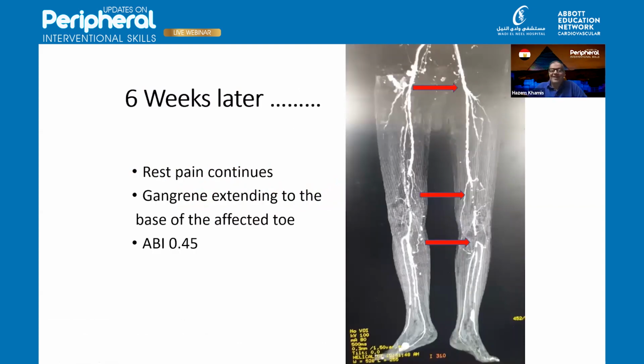Sharif, before this CT angio, Alberto, would you try again with a high pressure balloon, long balloon inflation, and then decide whether to leave the entry point or stent this entry from the start? I tell you, my position today is that we have really to look at the inflow status in a patient with a true critical limb ischemia, because we have seen that the distality in the toe is not absolutely acceptable.